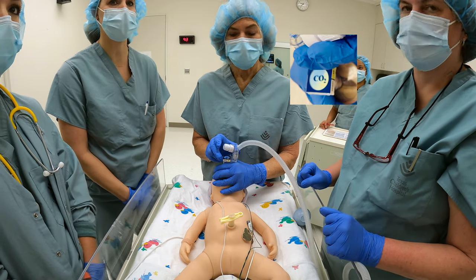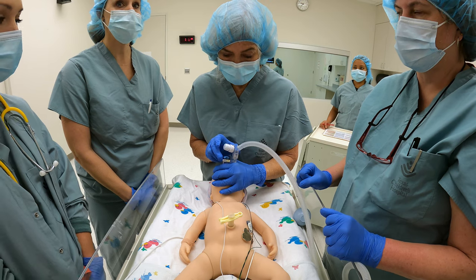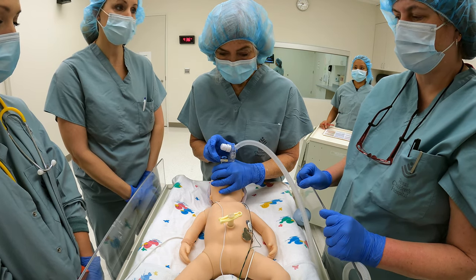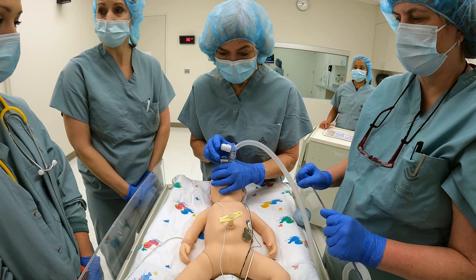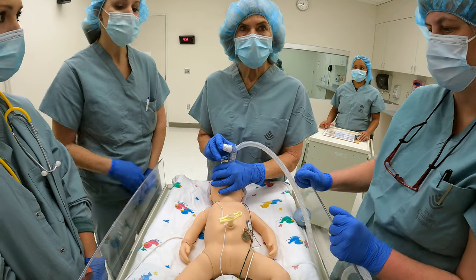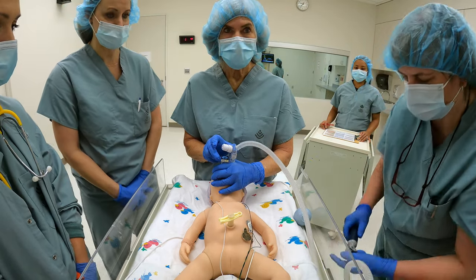The heart rate is still not coming up, and we've already tried our corrective measures with Mr. Sopa. I think the weak CO2 reflects low cardiac output. However, the heart rate is not coming up above 100, so we need an alternative airway. Does everyone agree? Agree. Okay. So with a 38-weeker, let's go ahead and get a 1-blade and a 3.5 ET tube ready.